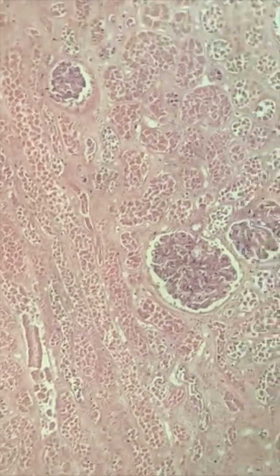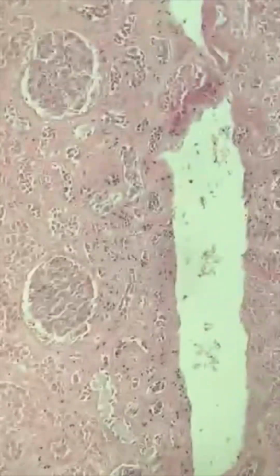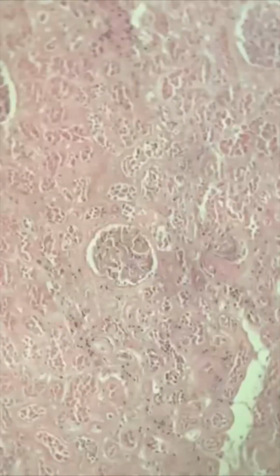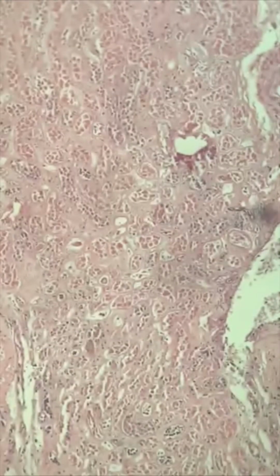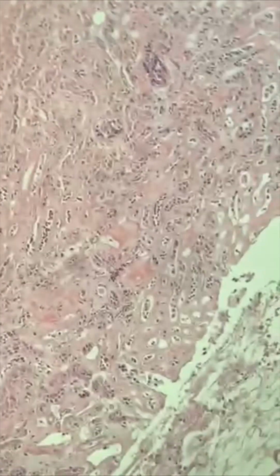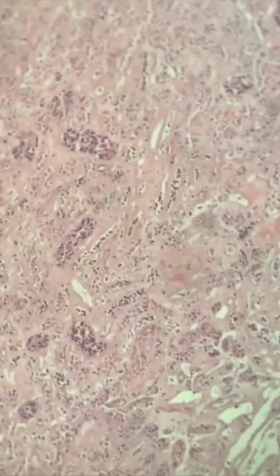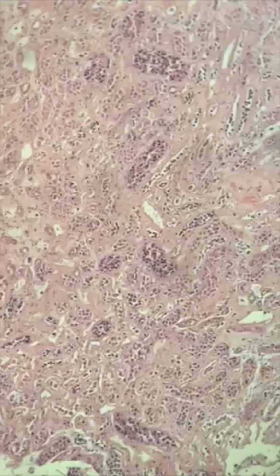As usual, I take multiple sections of kidney, so you can see another section of kidney. Again, acute tubular necrosis. Let's see if we can get some of the medullary component of the kidney. This is all cortical. That's where you see the nephrons, the glomeruli, and so forth. And then as we go down, I think we're getting into the medullary component, and that's all normal looking renal tubules, like the exiting collecting ducts, and so forth. Those are all normal. Okay, we'll go to the next slide.